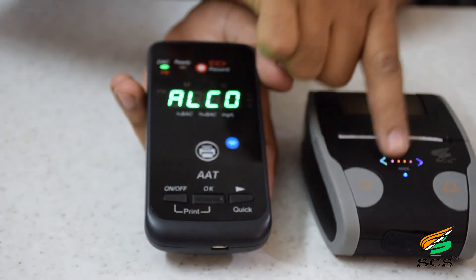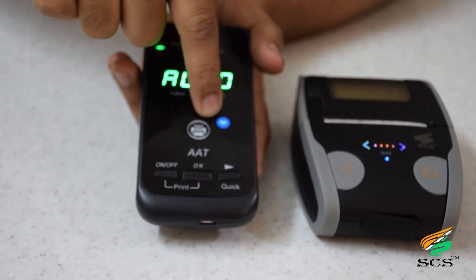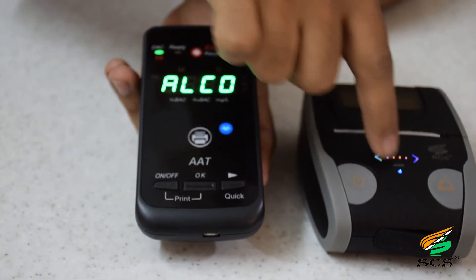Always remember that both LEDs glowing means both devices are connected.